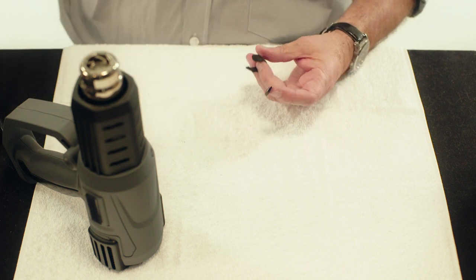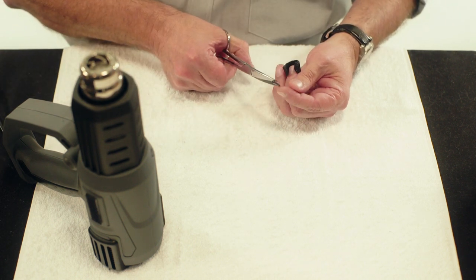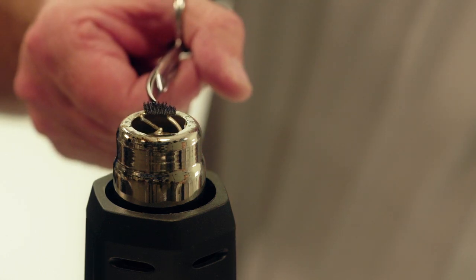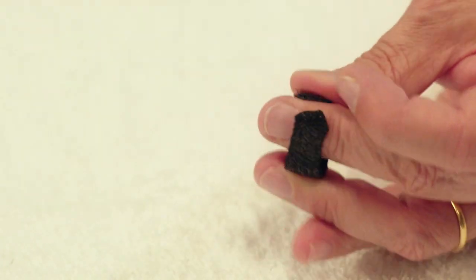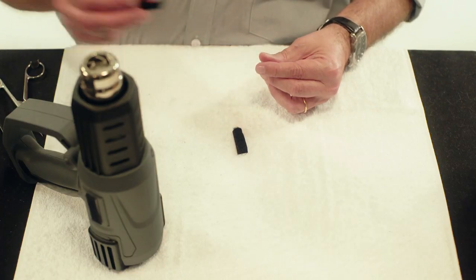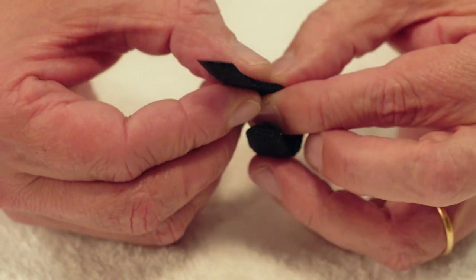heat gun. Heat the glue of the self-adhesive velcro hook and stick them both together. Heat the palmer side of the orthosis and attach a small piece of velcro loop.